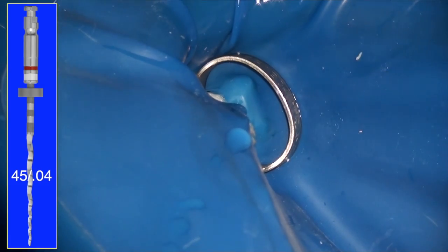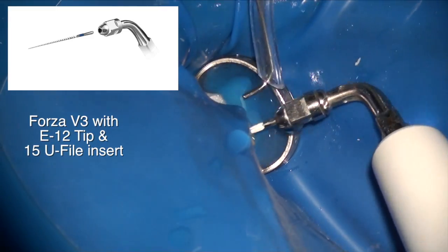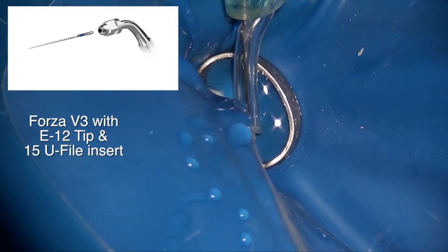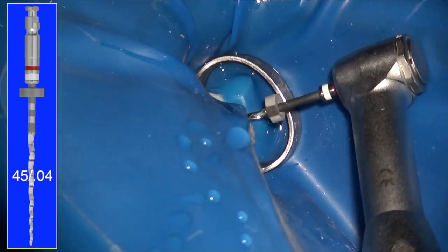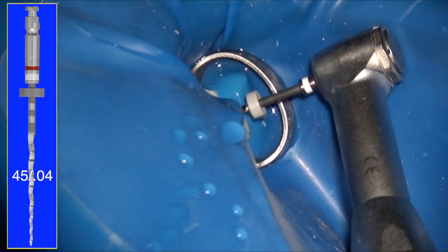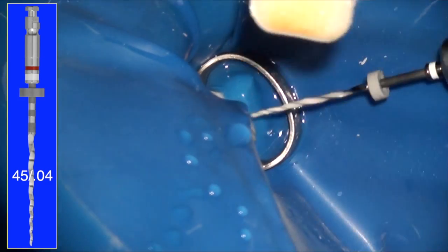Again, for a third time, I'm using the ultrasonic. This is the Forza V3 unit by Brasseler. Ultrasonic is very powerful and has these specific tips, which are size 15 or 20 file tips that you could put in there on the E11 and E12 tips with about a E1 setting, and you get very good removal of debris. Now I'm doing the same thing I did at a faster speed here.